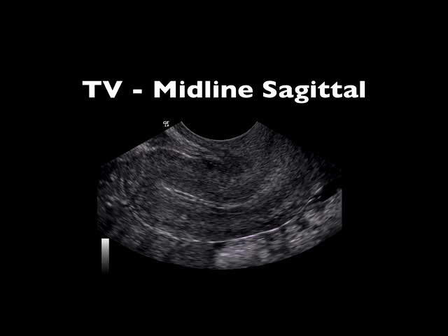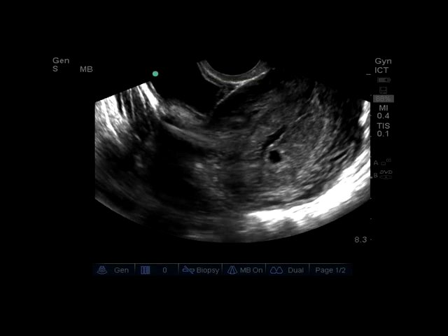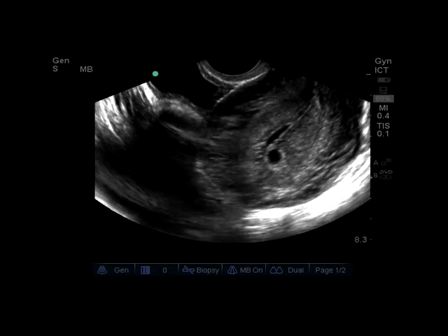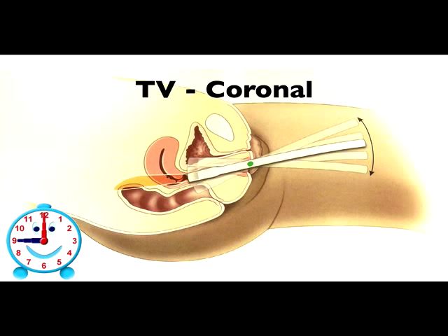Also notice the hyperechoic endometrial stripe which bisects the uterus. In this video we can see the bladder on the left side of the screen, so we know that is the anterior aspect of the patient. On the right side we can see the uterus. For the next part of the examination we'll be doing the coronal view of the transvaginal examination. We're going to rotate the probe with the probe marker to the patient's right, which from your view should be at the nine o'clock position.